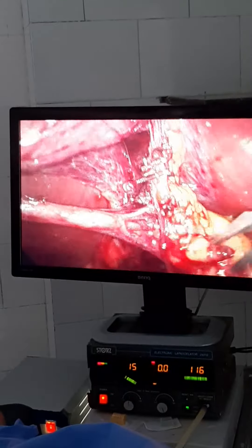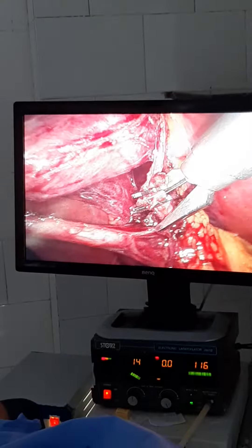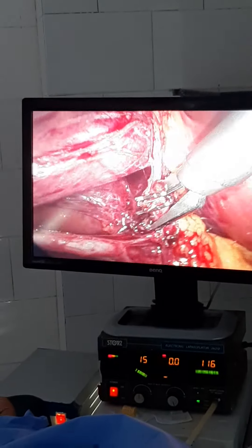This is the cystic artery itself, and I have to skeletonize the cystic artery before clipping. Don't clip the cystic artery blindly, because if you clip the cystic artery while it's like this, you may inadvertently clip the common hepatic duct.